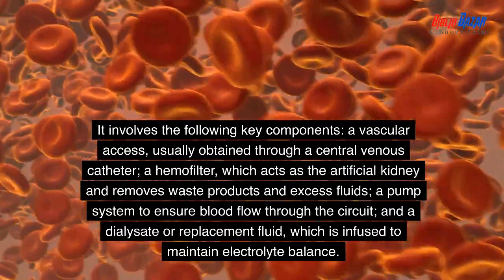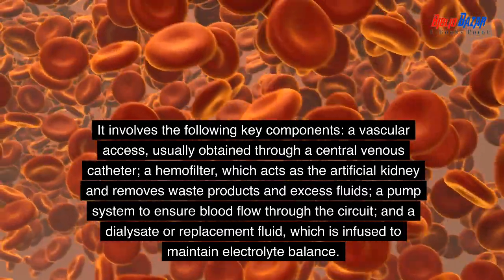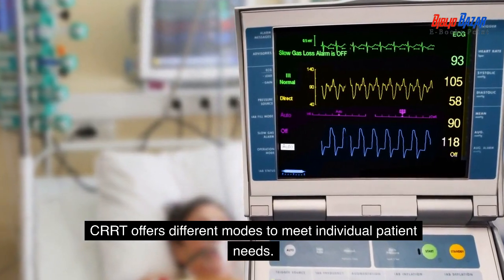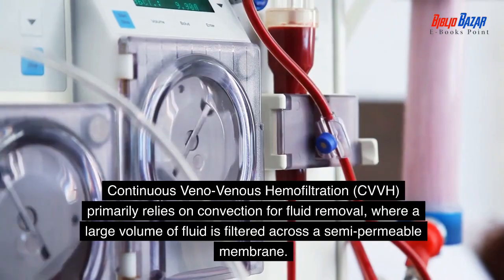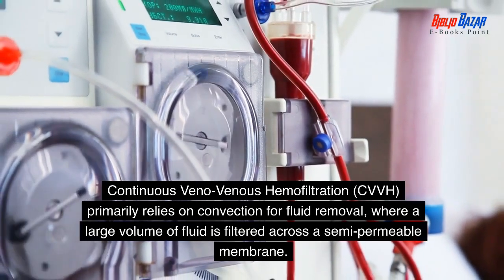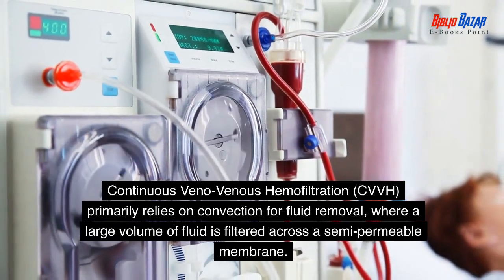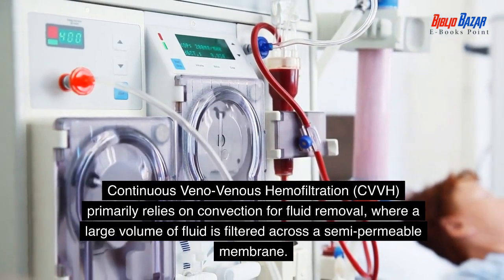Additionally, a dialysate or replacement fluid is infused to maintain electrolyte balance. CRRT offers different modes to meet individual patient needs. Continuous venovenous hemofiltration (CVVH) primarily relies on convection for fluid removal, where a large volume of fluid is filtered across a semi-permeable membrane.